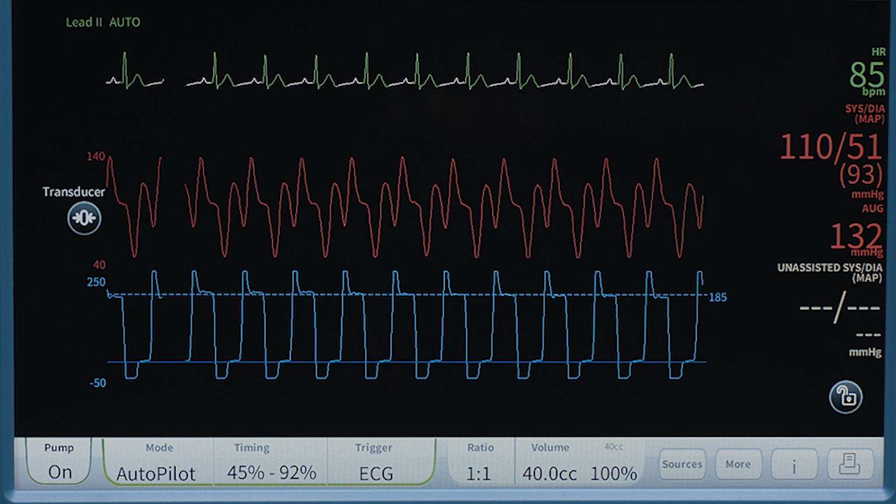If positioned too low, repositioning is recommended to the desired placement of 1 to 2 centimeters below the left subclavian artery. Reassess the occlusivity once repositioned. If the plateau remains greater than 25 millimeters of mercury higher than augmentation with proper placement of the IAB confirmed, reducing the balloon volume may be appropriate. A physician order may be necessary. Please follow your hospital guidelines.